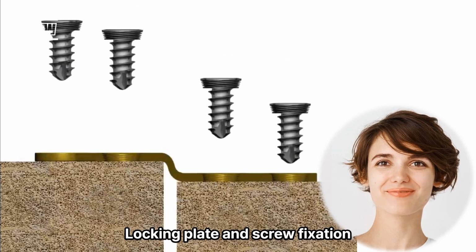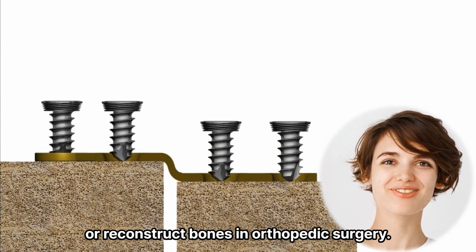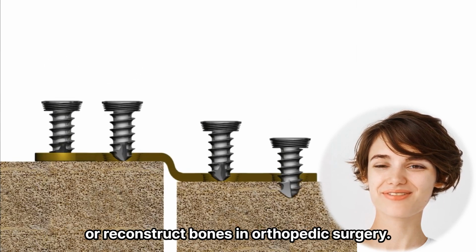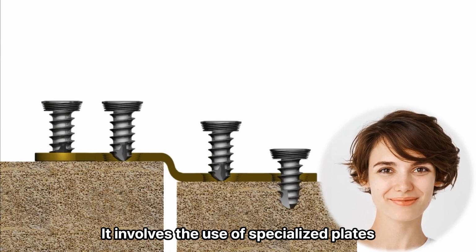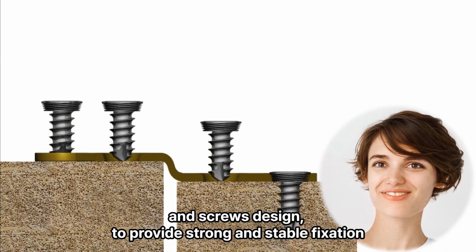Locking plate and screw fixation is a surgical technique used to stabilize fractures or reconstruct bones in orthopedic surgery. It involves the use of specialized plates and screws designed to provide strong and stable fixation.